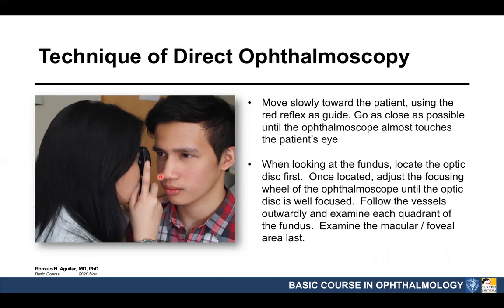Remember the effect of distance. So basically, the principle is the closer you are to the patient's eye, the greater the chances that you will be able to see a larger part of the retina. So try to go closer than this.